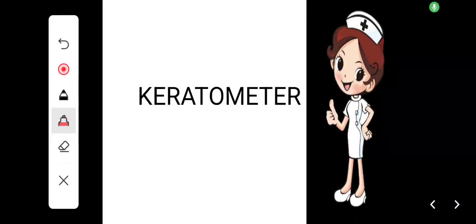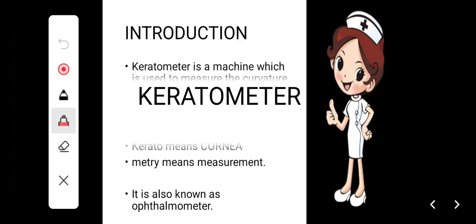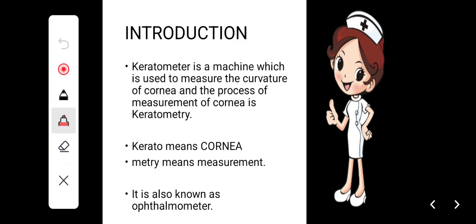Hi everyone. Today I am giving you information on the topic keratometer. So let's move to its introduction. Keratometer is a machine which is used to measure the curvature of the cornea.